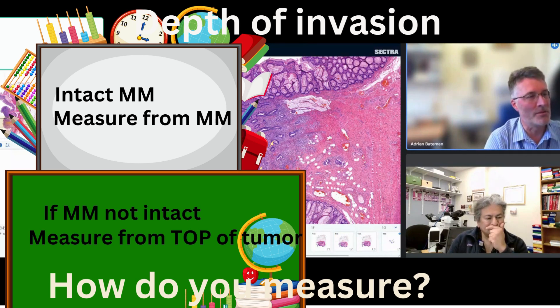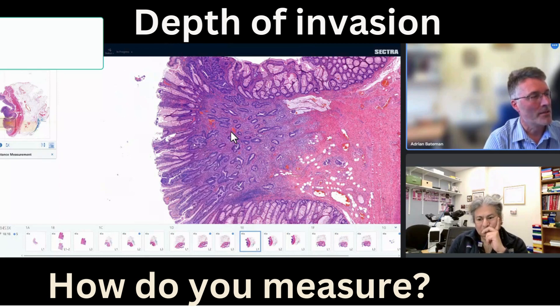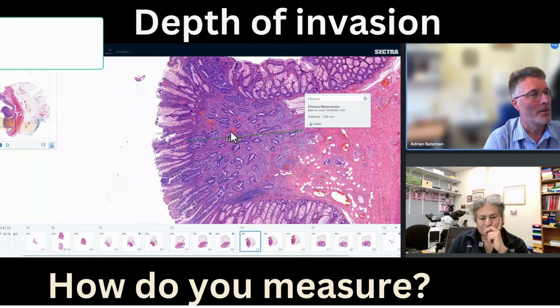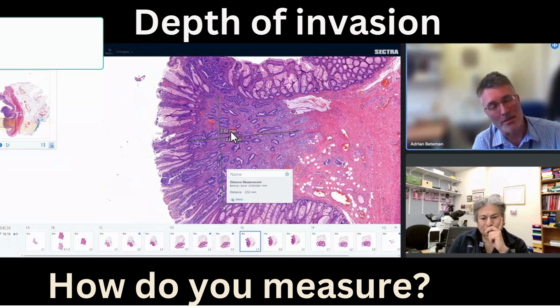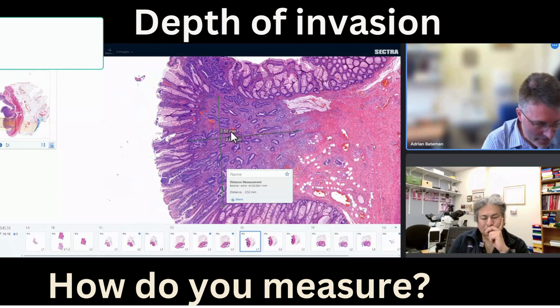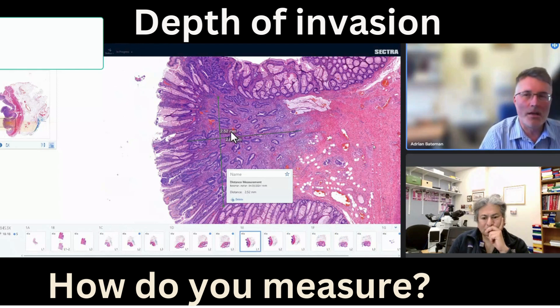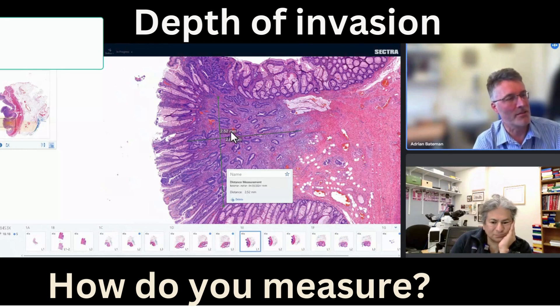Because it's very easy to end up with a digital measurement that looks very accurate, but there are potential errors quite apart from the ones already mentioned with splaying of muscularis mucosa fibres and also the state of the surface. For example, it would be quite easy to take a measurement from here, maybe down to here — that's 2.6 millimeters of depth. And then from over here across to here, that's just over 2.5 millimeters width in this section. But that is only part of the lesion.